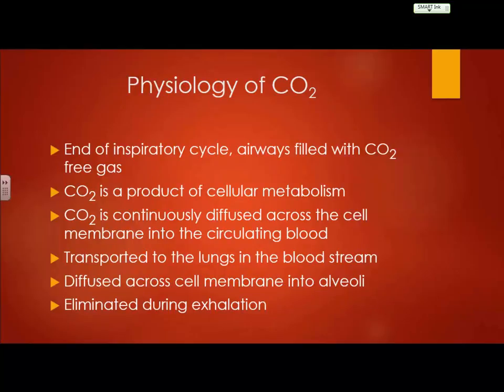At the end of the inspiratory cycle, the airways are filled with CO2-free gas. Why? You just breathed in and you just filled up with oxygen. The ambient air that we're breathing in right now has 21% oxygen, mostly nitrogen, and some other trace elements. So at the end of the inspiratory cycle, as we're breathing in, there's no CO2 there. Why is that thrown in here in relation to CO2 monitoring? Because it's going to be baseline, it's going to be zero. So that gives me the indication that I'm breathing in when I've got a flat baseline.